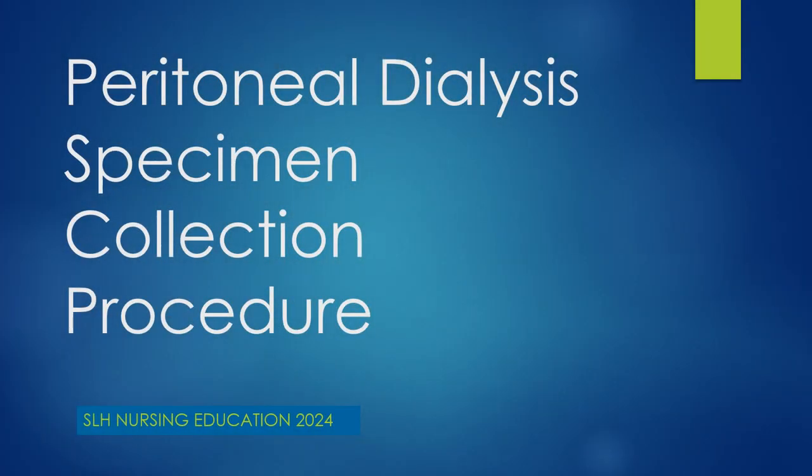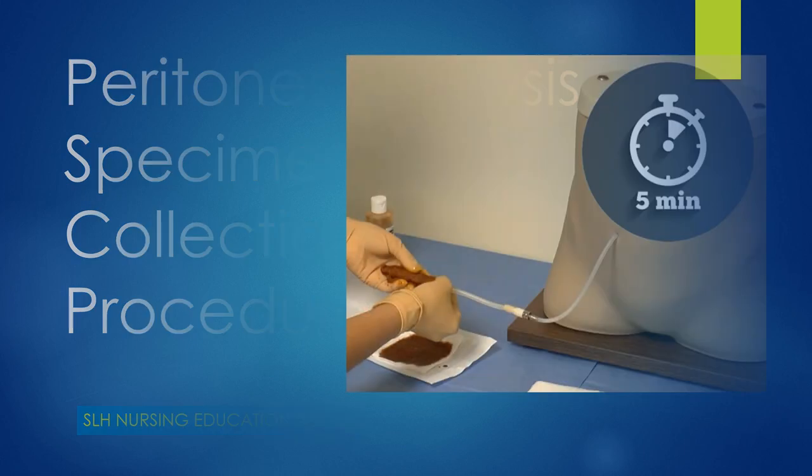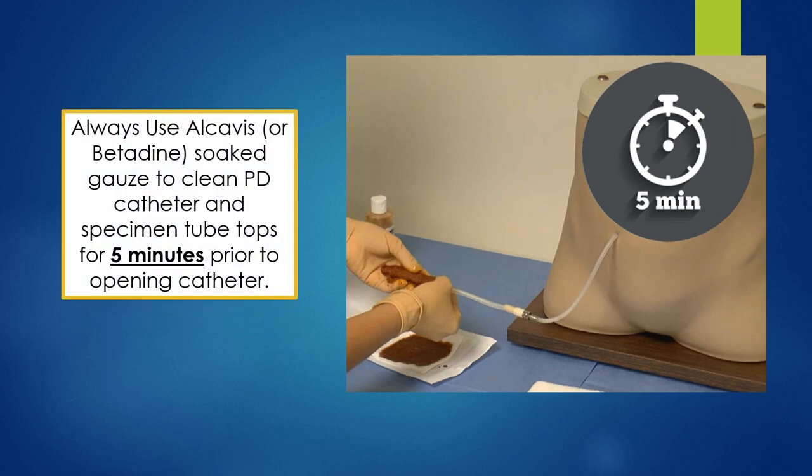This is a review of the peritoneal dialysis specimen collection procedure. Remember to maintain sterile technique. Use Alcavis-soaked gauze to clean the PD catheter and specimen tube tops for 5 minutes prior to opening the catheter.